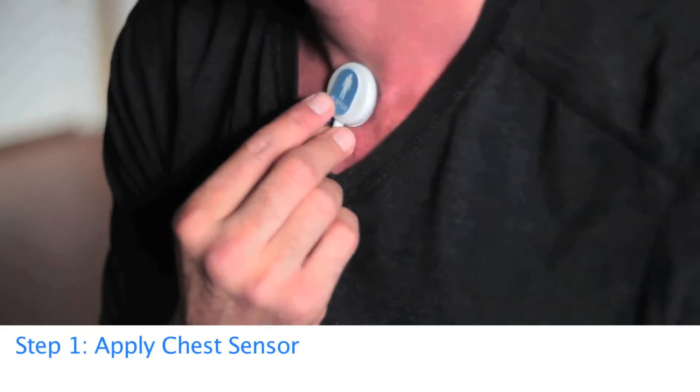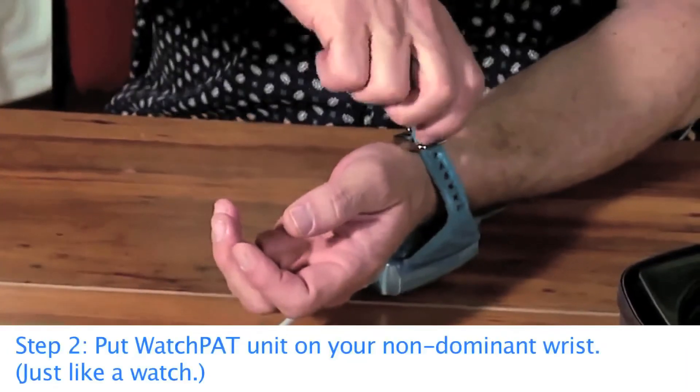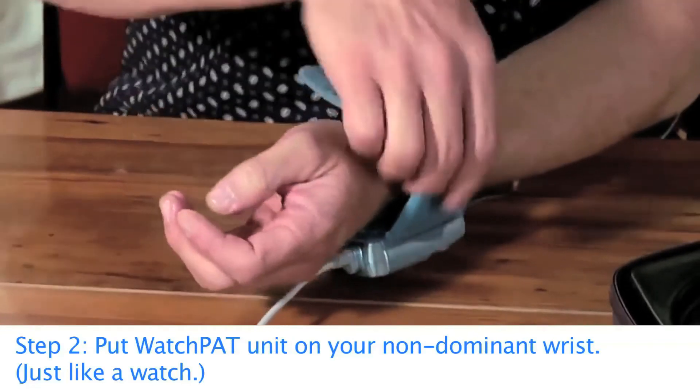Apply the chest sensor. Then put the WatchPat unit on your non-dominant wrist, just like a watch.